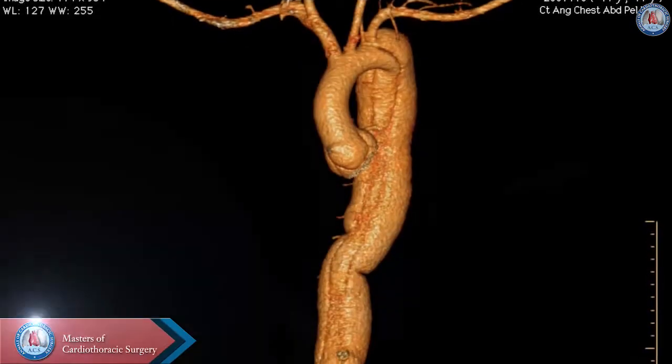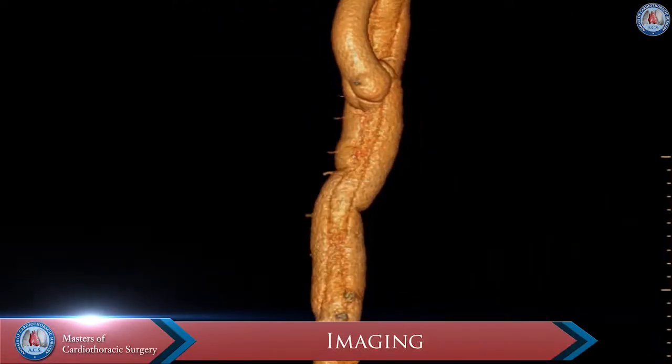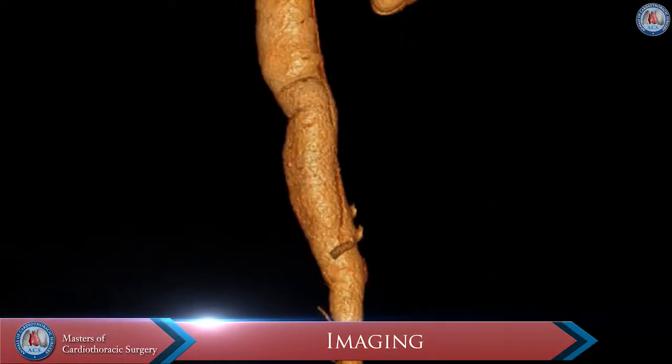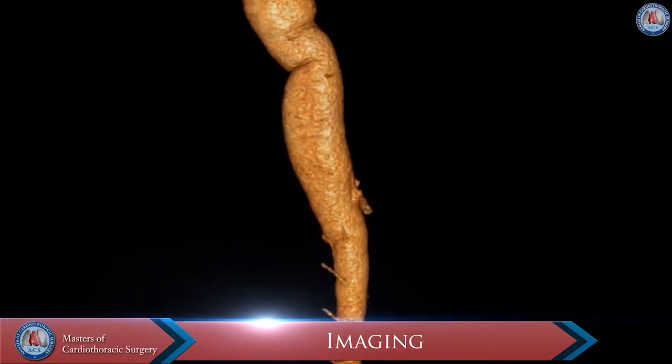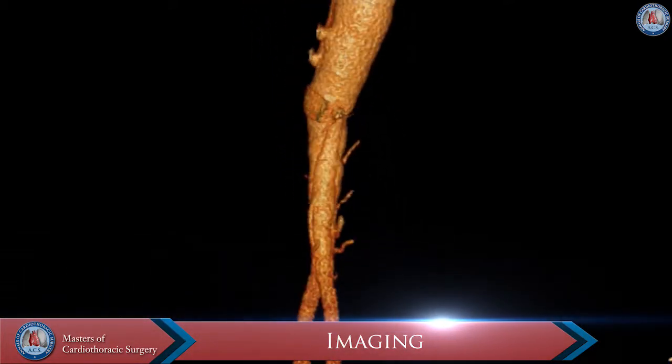The CTA of the chest and abdomen reveals a chronic dissection with enlargement of the proximal descending thoracic aorta extending down to the celiac axis.